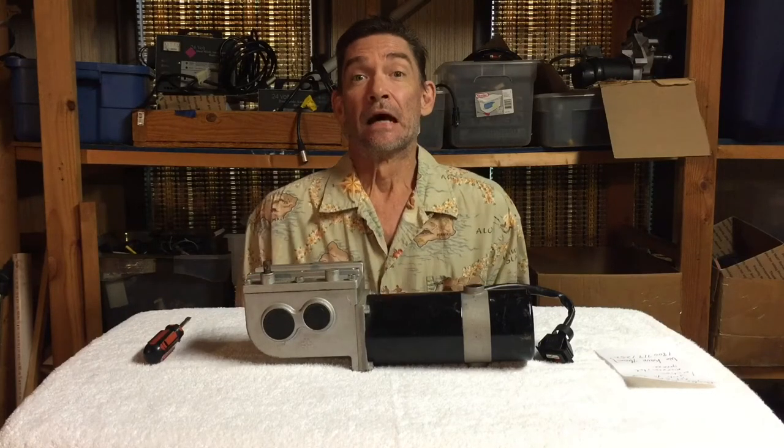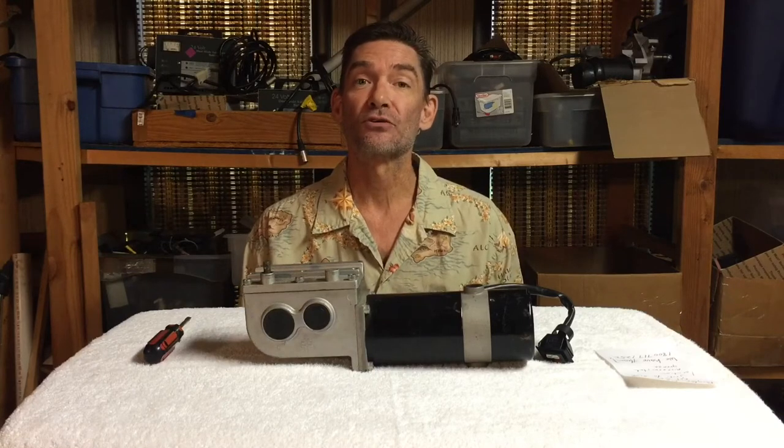Hey there, this is Frank with Electric Wheelchair Parts. It was brought to my attention that I should do a video on brakes and brushes.